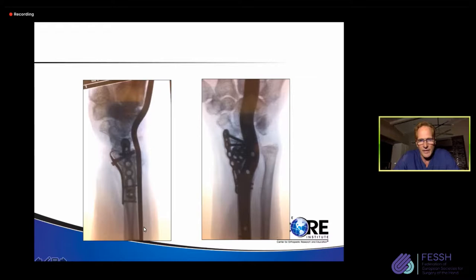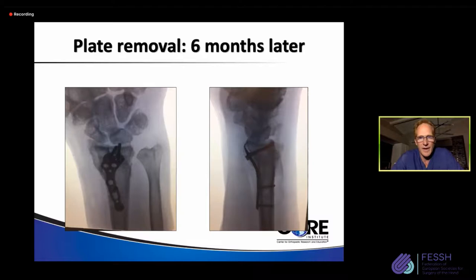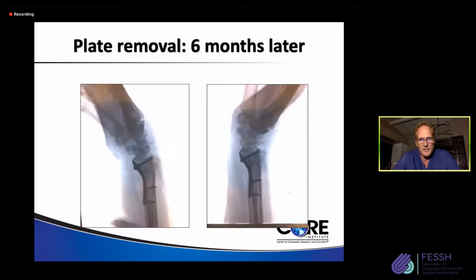Went back, removed the plate again, a COVID-19 a little bit later than we'd like. About twice as long as we'd like. So 6 months later, left the volar plate on because we didn't feel a need to take that off. It wasn't bothering the patient. And I think pretty good result here. Again, range of motion 6 months as the plate comes off, not perfect. Just very little motion, mostly coming from the midcarpal joint, not so much the radiocarpal joint, but we hope that is going to loosen up with physical therapy as well.